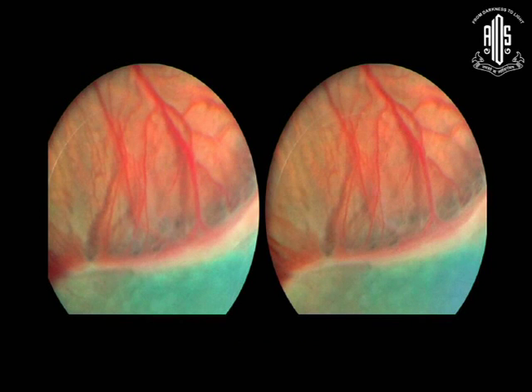For me, the driving force was retinopathy of prematurity, a disease in which I have both a personal and professional interest. When we used to screen a long time ago, I used to carry an indirect ophthalmoscope with a digital video camera. That was the first digital video indirect ophthalmoscopic imaging, which I introduced in 2006. But the thing was very cumbersome and costly, so I had to leave it without taking it further.